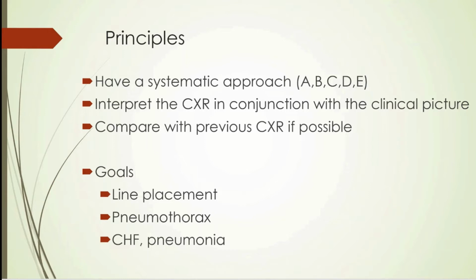You need to look at the clinical picture too. Just getting a chest x-ray alone without any clinical picture makes things difficult. It's so much easier if you have that clinical picture. So obviously if you're reading your own x-ray, you'll have that clinical picture, but if you send an x-ray off to a radiologist to be read, make sure you include a decent clinical picture that helps them out. If they have a previous chest x-ray that's huge, you should be comparing it. It makes it really easy to pick out changes and just makes your life easier in general.